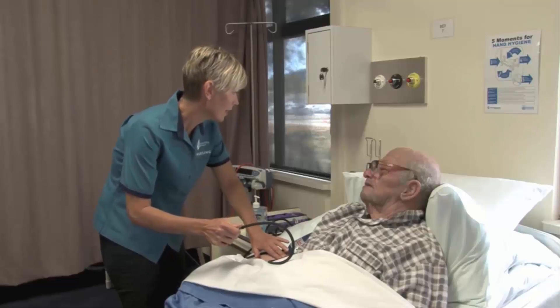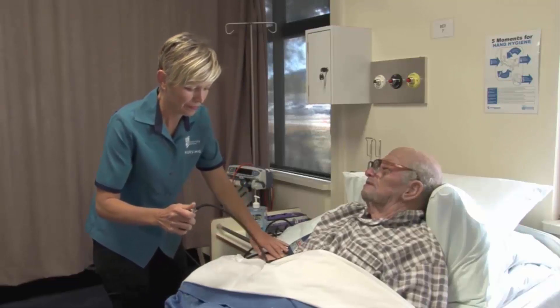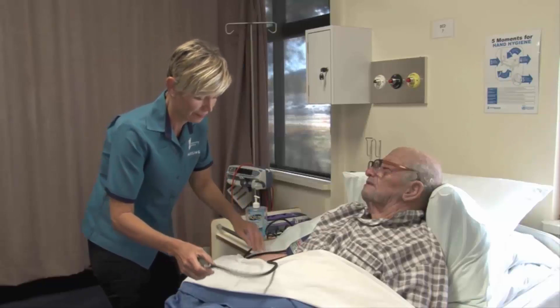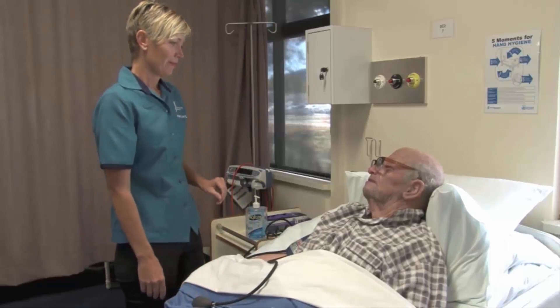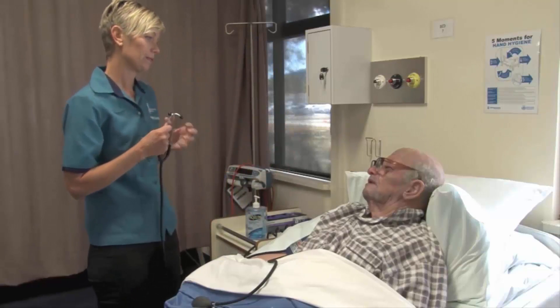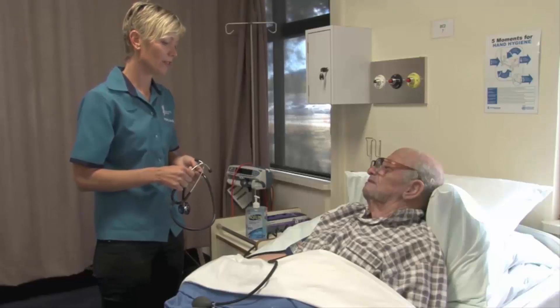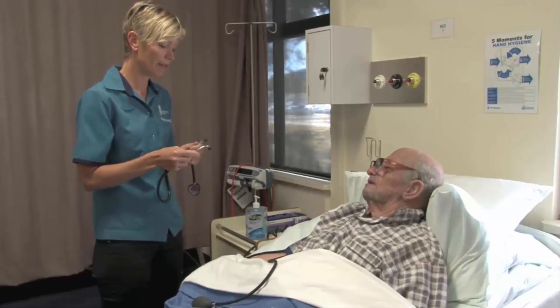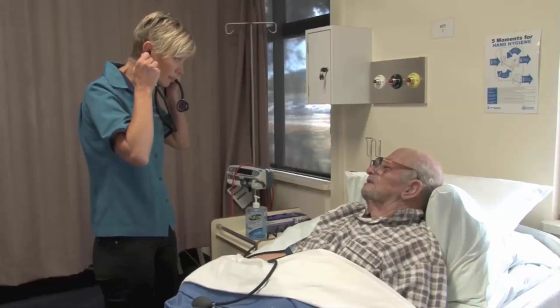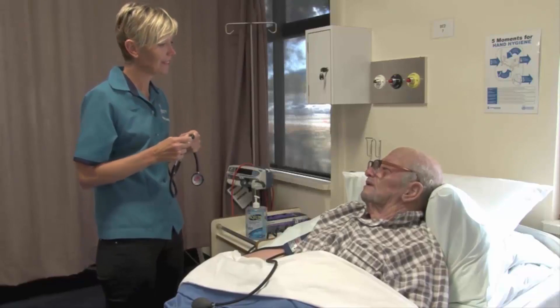I can't feel it anymore — around 120 millimeters of mercury. Now, apparently you then have to inflate it 30 millimeters of mercury above that. That's very true, and you know, some people just guess that and they have no idea. You must feel that brachial pulse before inflating — it's very important if you want to get an accurate reading. I have read every single one of my grandson's books!